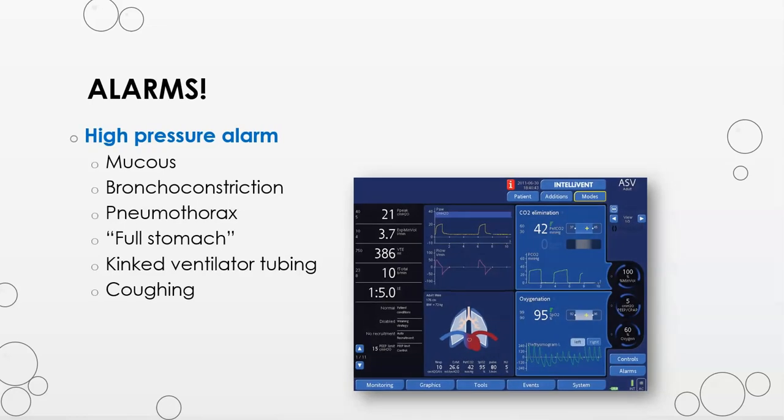In January 2014, as one of the national patient safety goals, hospitals were required to have policies and procedures in place to manage alarms. This included acceptable parameters and who has the authority to change alarms. This pertains to all alarms used for patient safety, which includes mechanical ventilators. No alarm should be ignored. There are 3 that I want to mention. The first one is the high pressure alarm. The ventilator is attempting to deliver a set tidal volume under a set pressure, but is meeting resistance.